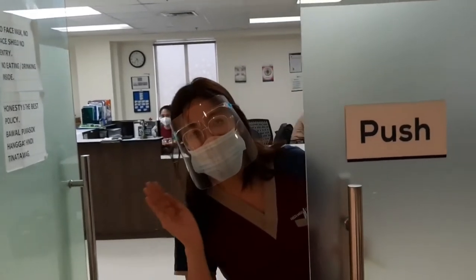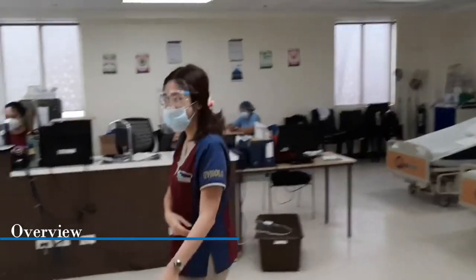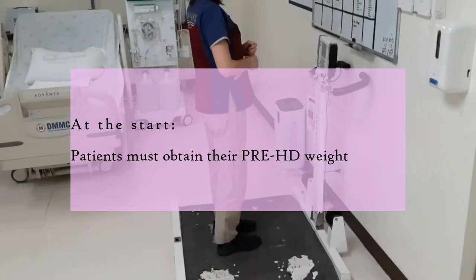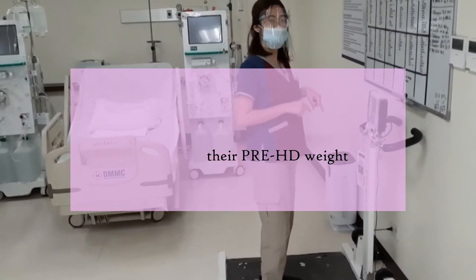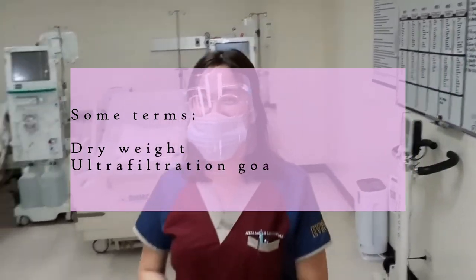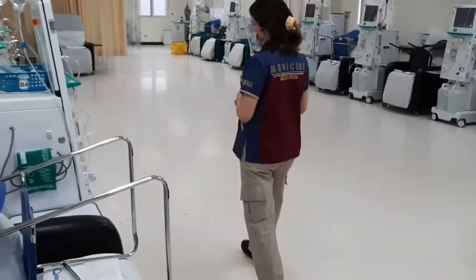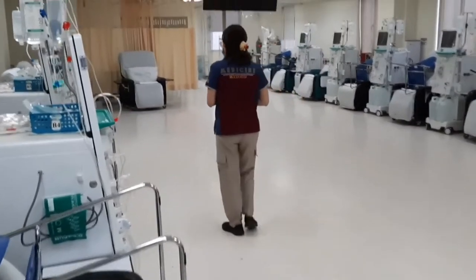Hi guys, welcome to Hemodialysis Physician. So for the routine, the nurses and patients usually get the pre-HD weight using this scale over here. It will then be compared with their dry weight — the weight considering that they are not congested or don't have any fluid excess. That is where you will actually base your ultrafiltration goals, or your target — that's the same amount of fluid that you take out from them.